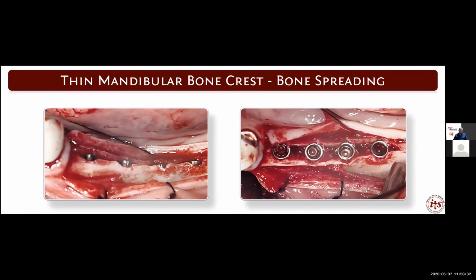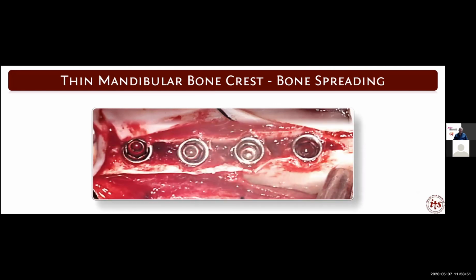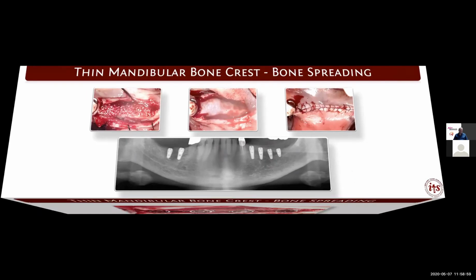You put the implant in, you let it sit for maybe a minute after 2 or 3 threads are there, then another 2 or 3 threads, let that relax the bone until the implant is firmly inside. So you can go from this to this. But the slower you go, the faster you get there. So be very careful and not do that too quickly.